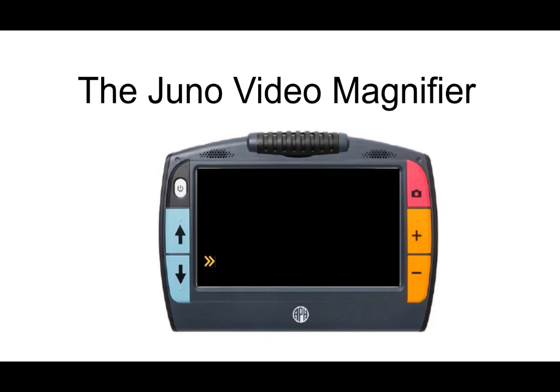Today we're going to take a closer look at the menus and how to make some common changes in those menus that will help the Juno appear and run in a way that maybe is more convenient for you and your student. So let's go ahead and get started.